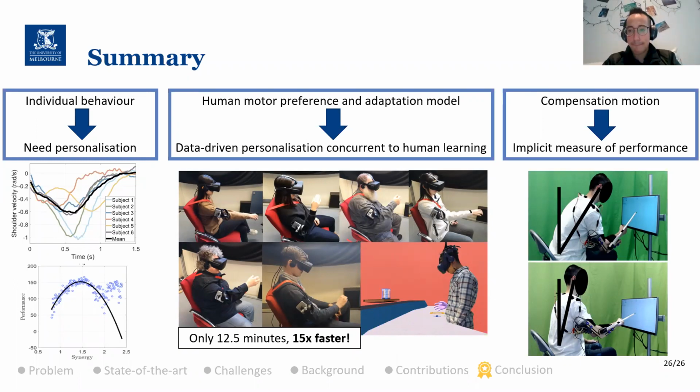Yeah. I wonder if you've looked at cases where, of course, having a large variety of tasks is very difficult, but if you had reaching, but the object you're reaching for moves side to side, up or down, forward or back a little bit, so it's different distances and angles, whether there are consistent synergies that occur between shoulder and elbow, or whether you would also need to know the intended reaching position to have the right synergy. Perhaps there's some kind of mapping from goal location to the synergy angle. Have you looked at that?